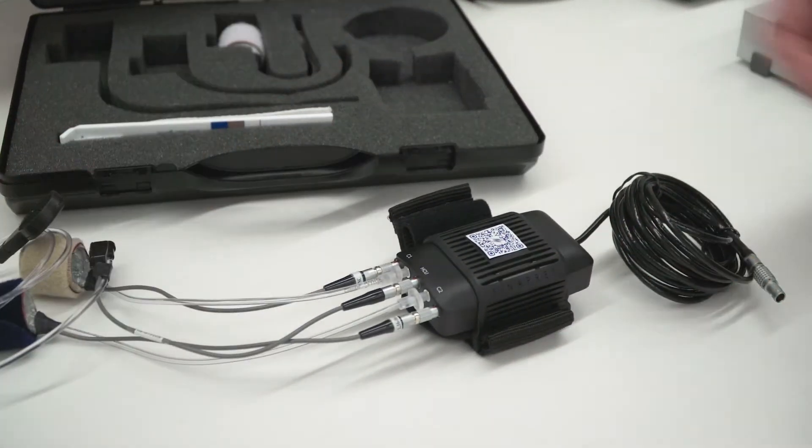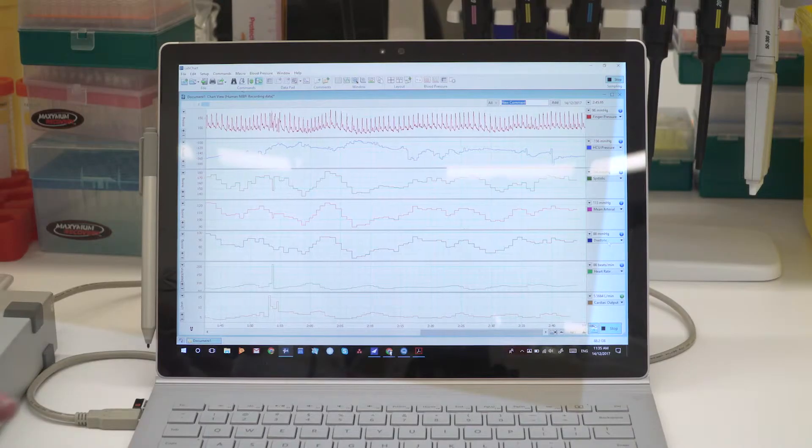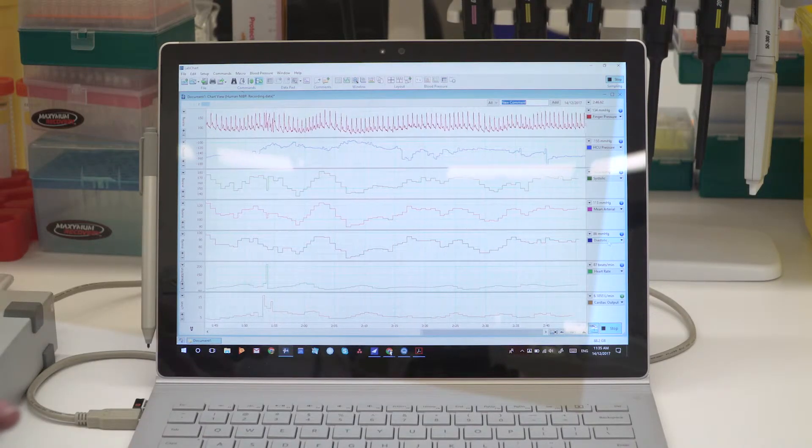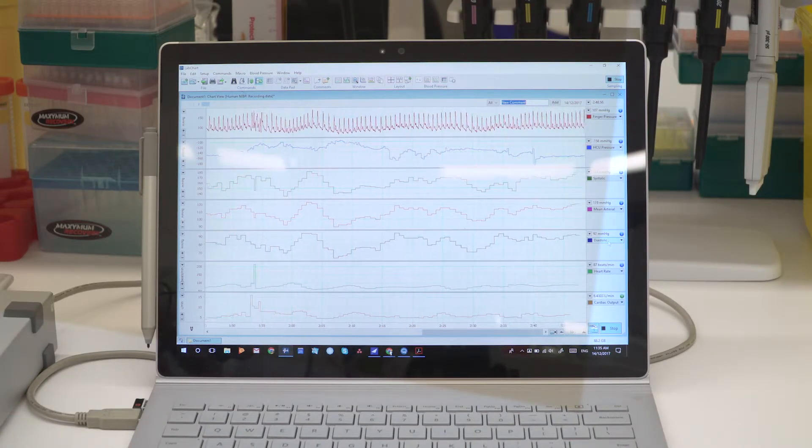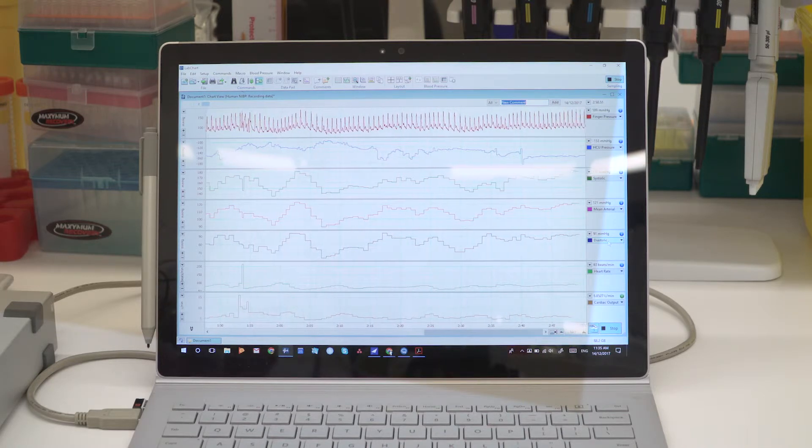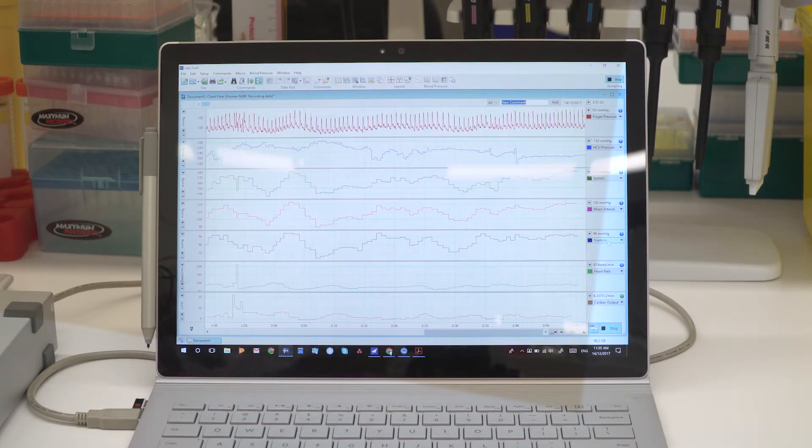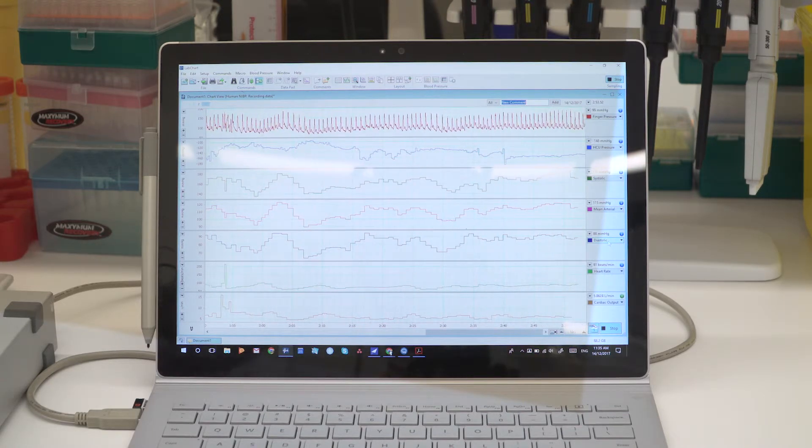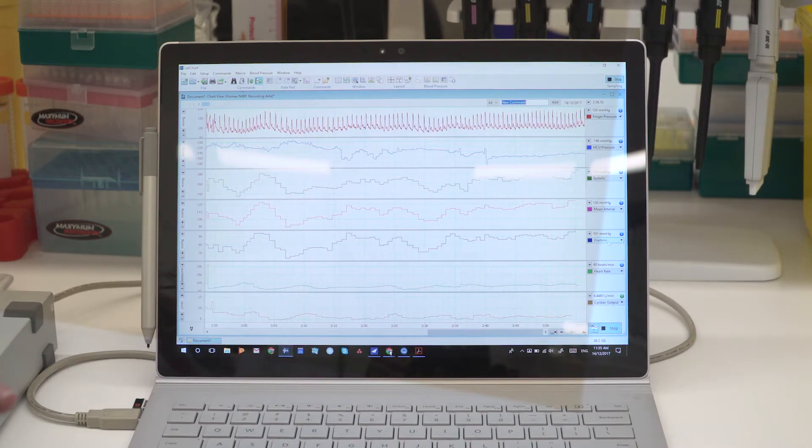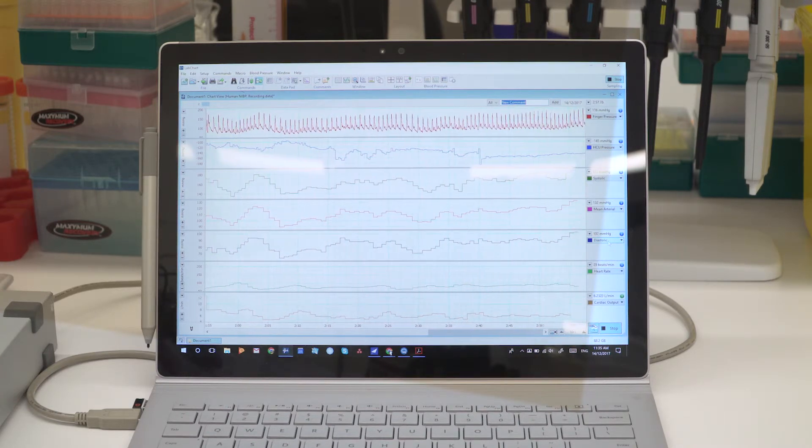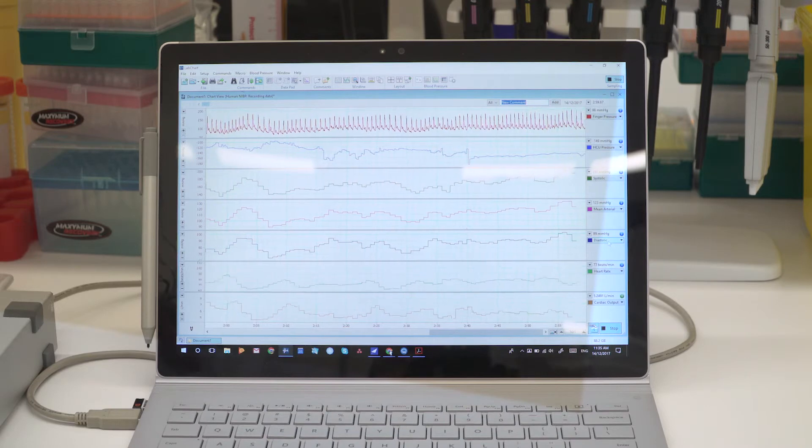Alongside the release of this new hardware, we'll also be releasing a new extension for LabChart, which we're calling NICO, or Non-Invasive Cardiac Output. This extension uses published and well-validated methods for estimating cardiac output from this non-invasive blood pressure signal.